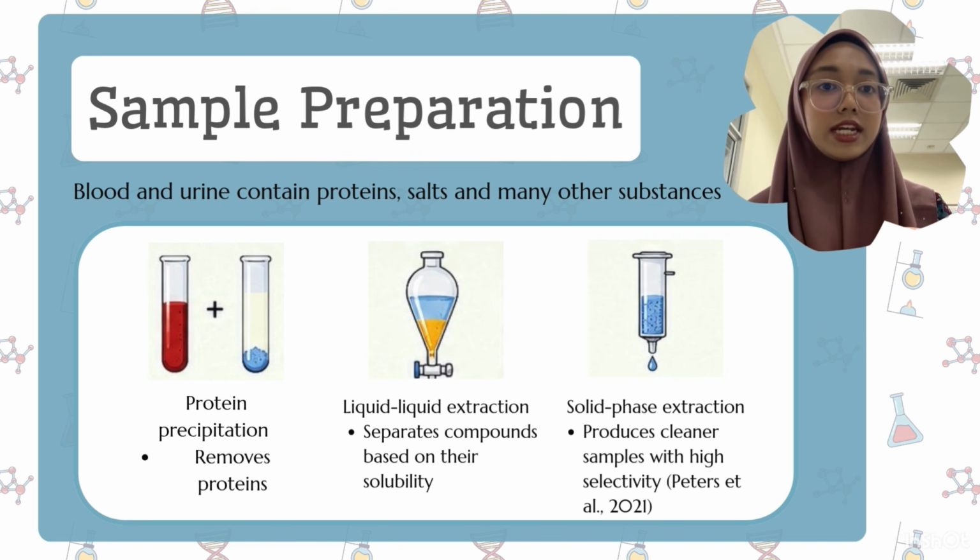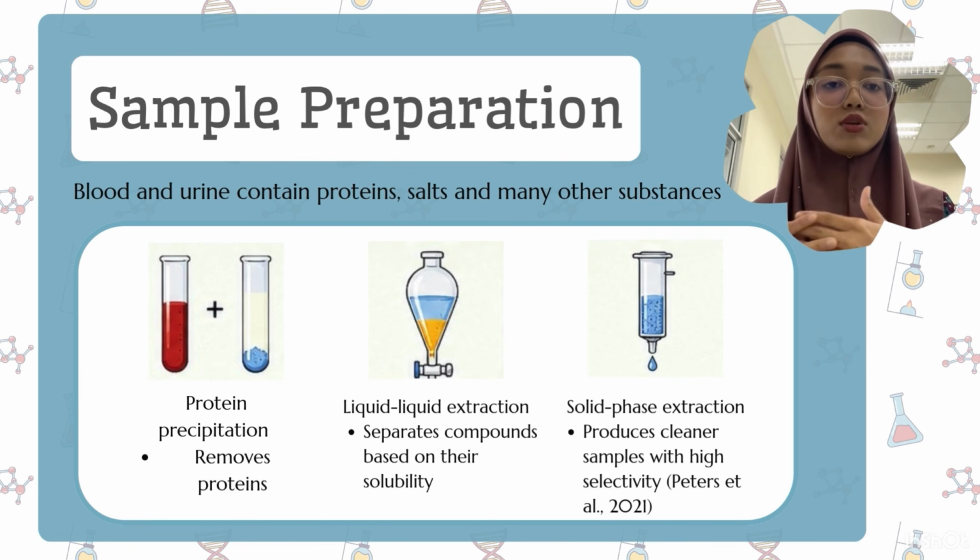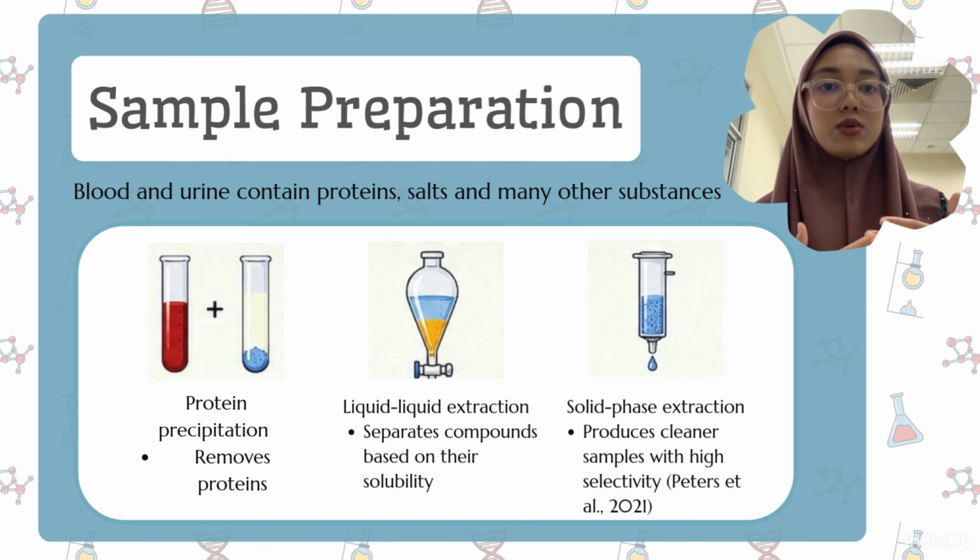be extracted. This can be done by using protein precipitation, which removes protein, liquid-liquid extraction, which separates compounds based on their solubility, or solid phase extraction, which produces cleaner samples with higher selectivity and sensitivity.